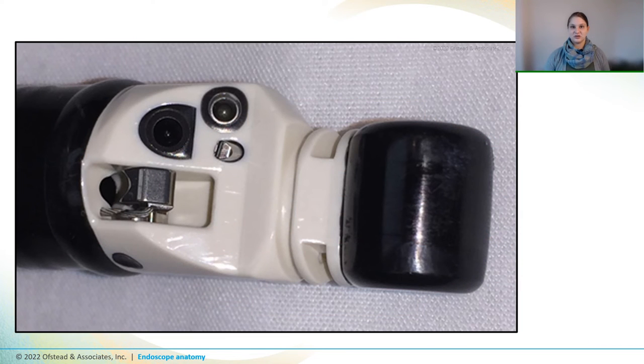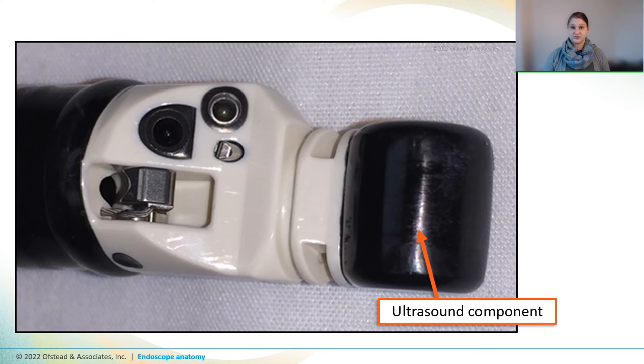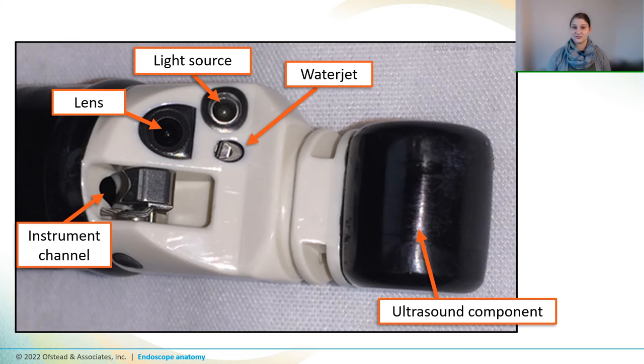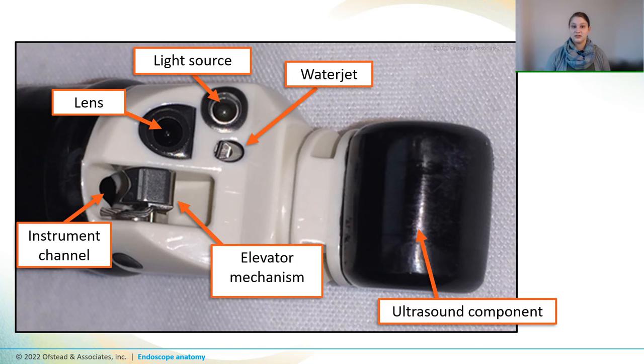Here's another common type of EUS scope called a linear array EUS. This one also has an ultrasound component on the distal end, but on this one it's black instead of pink. And it has a camera lens, a light source, and a water jet outlet, just like other scopes we've seen. It also has an instrument channel, but this looks a little different from the other scopes we've seen. It has an elevator mechanism that's used to manipulate instruments that come out of the channel so that they can go sideways out of the scope instead of straight out the distal end like most other scopes.